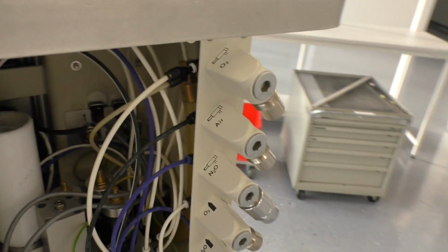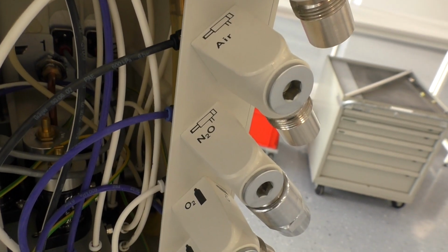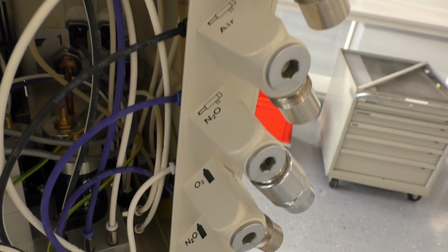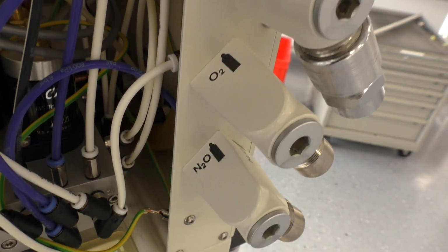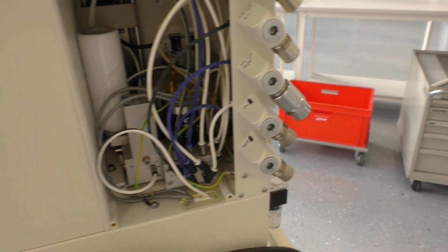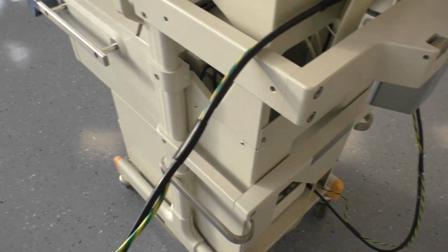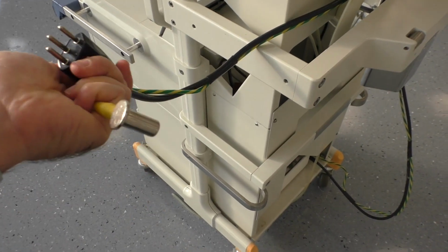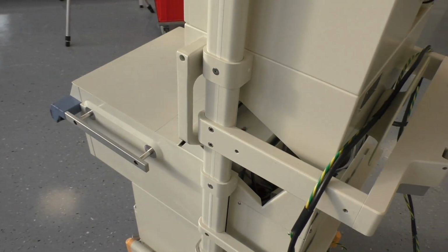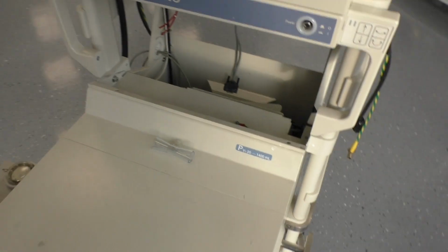Here we have the inlets for oxygen, air and nitrous oxide from the hospital supply. Then we have oxygen and nitrous oxide from bottles, so that's the backup in an emergency situation. Then typical for medical equipment is this additional earth plug. That's very important, so that the patient doesn't get hurt by an electric shock.